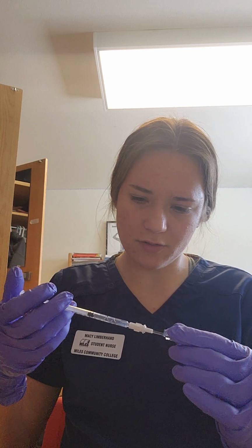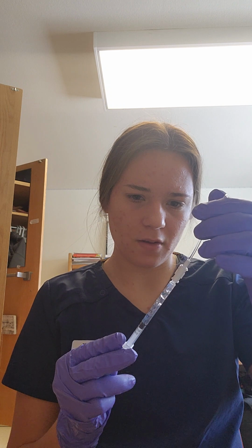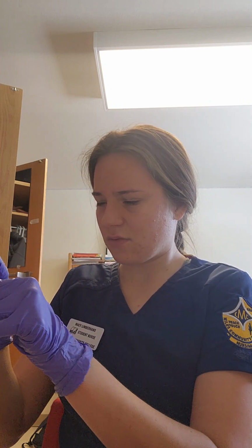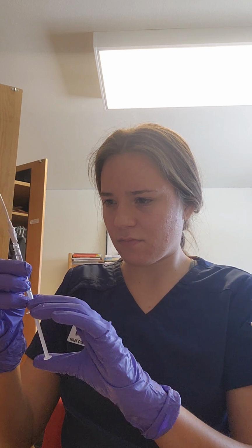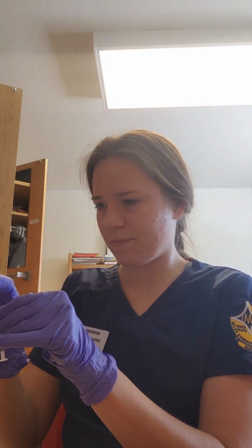This is not working super well, so I tip it upside down. Okay, I'm going to see how much I have here because I have a ton of bubbles. Okay. Now I have no bubbles. And I have to go grab a needle.